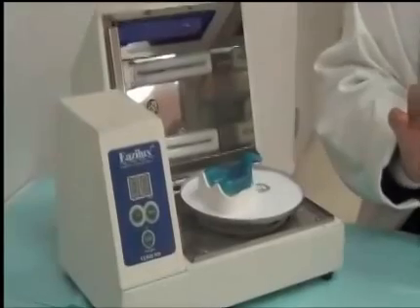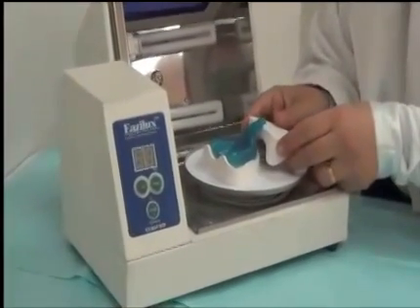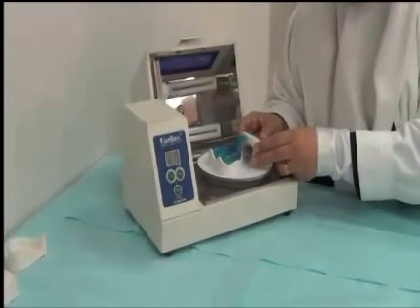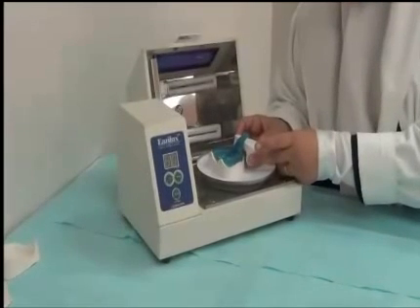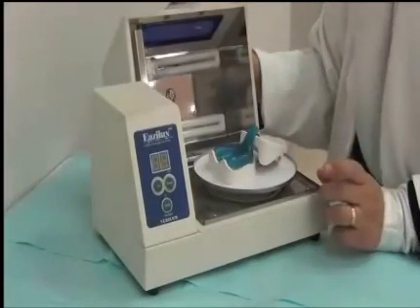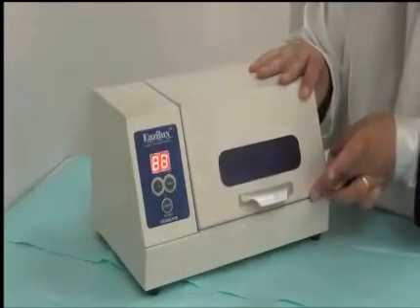We might get another cast, tool, or a cup, or any other hard object that could support the handle while light curing the first cure. Stabilize it, make sure it's stable, and then we begin our light cure.